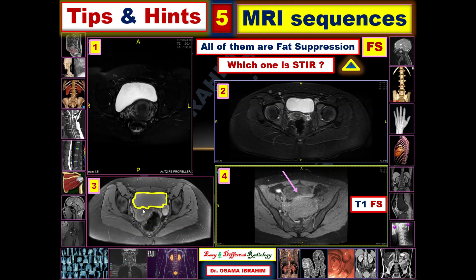Image number four is T1 fat suppression due to water appearing as low signal in T1. If you look at this other image, the urinary bladder shows intermediate signal — not bright like T2, not dark like T1. The gluteus muscles and other muscles appear brighter than the bones, such as the iliac bones, and the fat is suppressed.